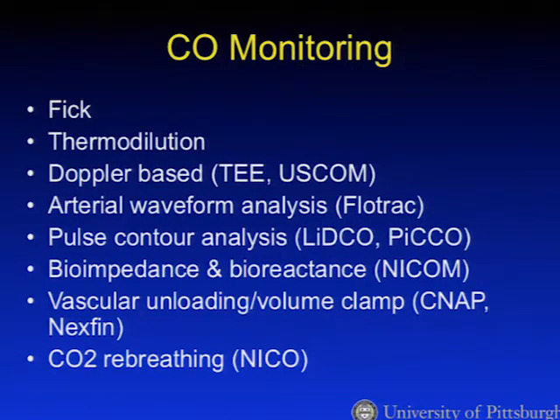On a related subject, arterial waveform or pulse contour analysis are integral to some of the less invasive methods used for cardiac output monitoring that we'll be briefly discussing as well.